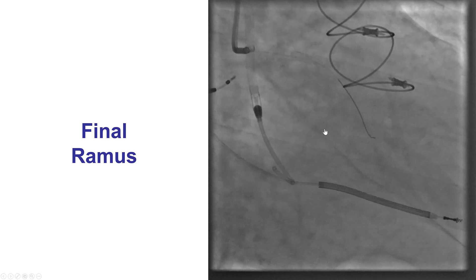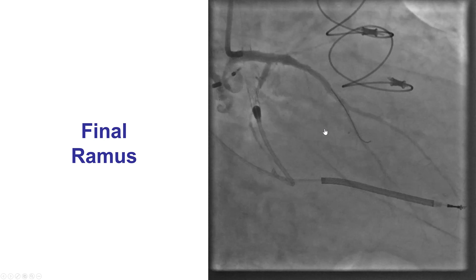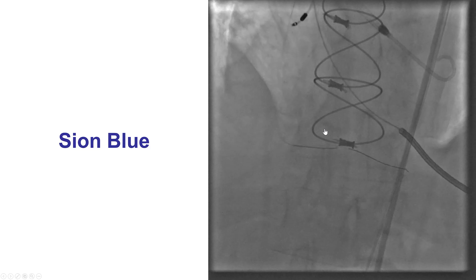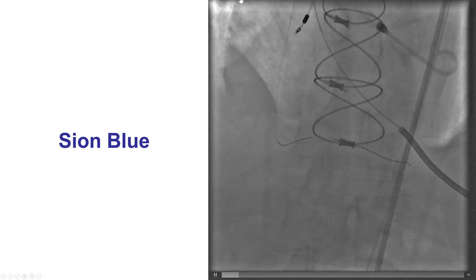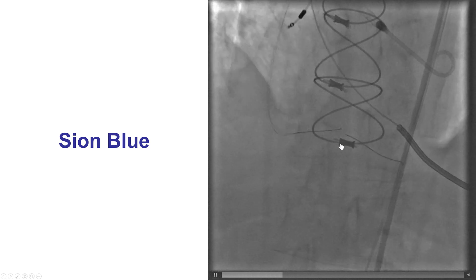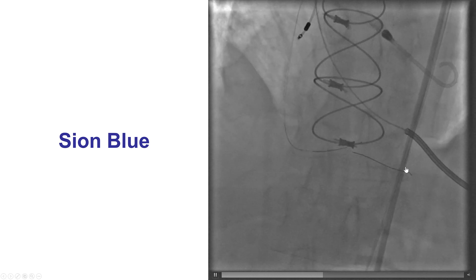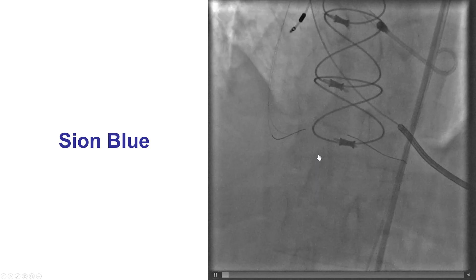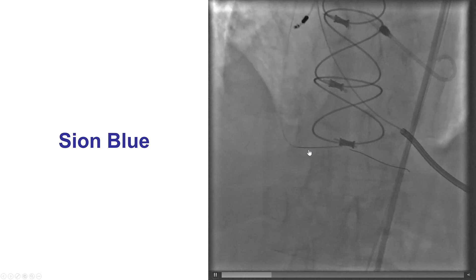The patient remained stable during this part of the procedure without any chest discomfort or hemodynamic compromise. We then changed to the right coronary artery, engaging the SVG with a multipurpose guide. We inserted a workhorse wire in the posterolateral branch, but had a lot of difficulty getting into the posterior descending artery, which had a tight ostial lesion.